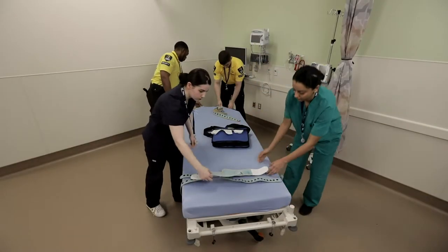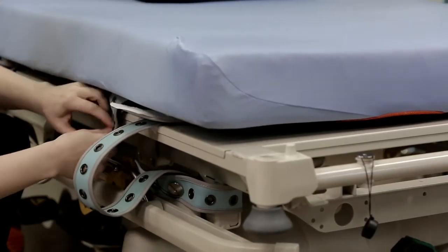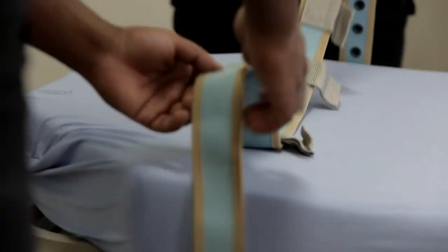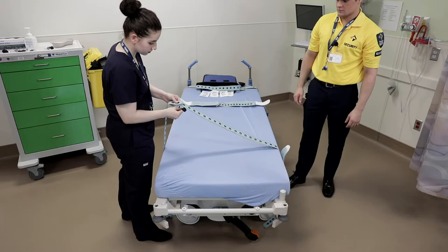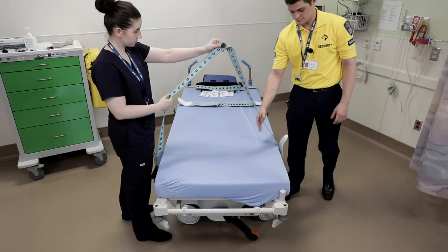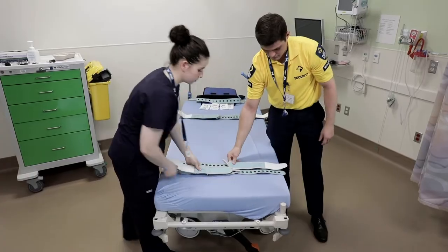Tuck the limb belts under the mattress for rapid retrieval and to reduce patient trauma when approaching the stretcher. Place the torso control belt at the head of the stretcher where the team leader will be positioned. For surprise visits and to speed up application, keep the long end of the limb belt connected and ready to go. You can simply attach the long portions of the straps together and pass them under the stretcher to the team member on the opposite side.